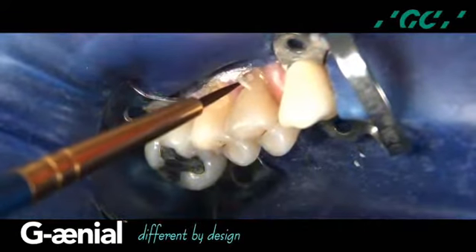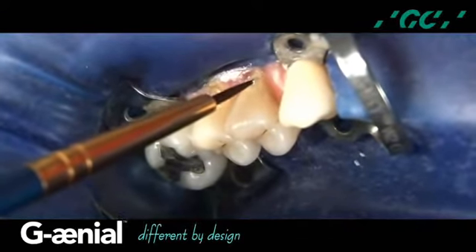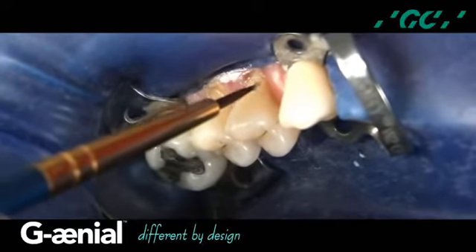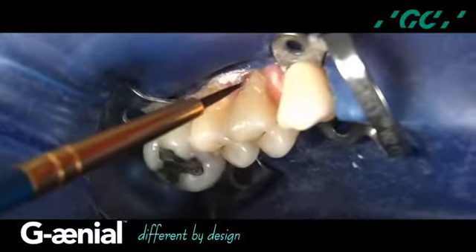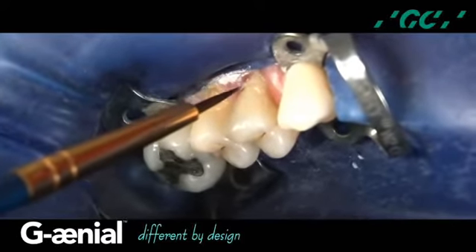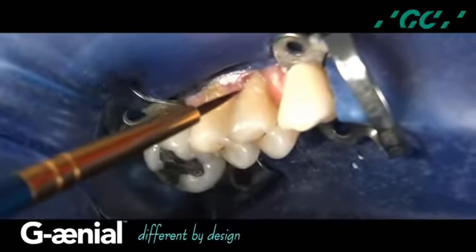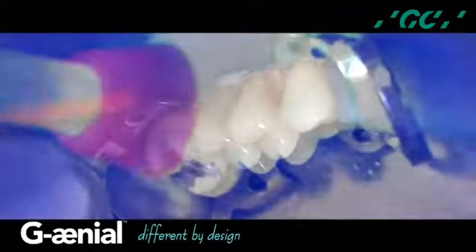Notice the viscosity and stability of the material on the brush — this allows for precise placement. For the final enamel layer, I use an AE shaded Gineo Universal Flow and sculpt the material with a double-aught sable brush. An ideal emergence contour can be developed if adequate space remains in this enamel zone, and the material is light cured for 10 seconds.